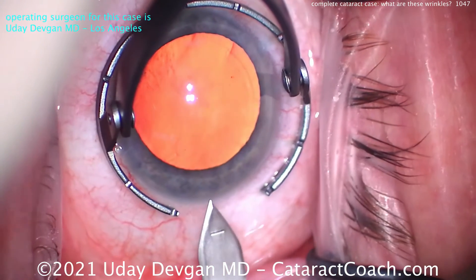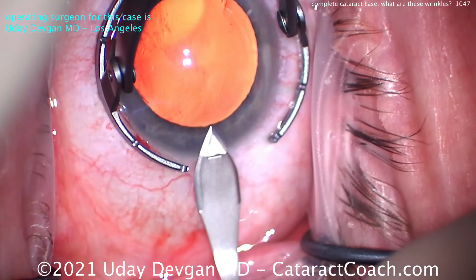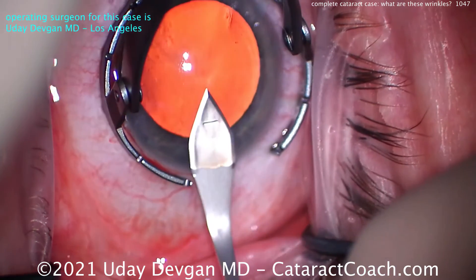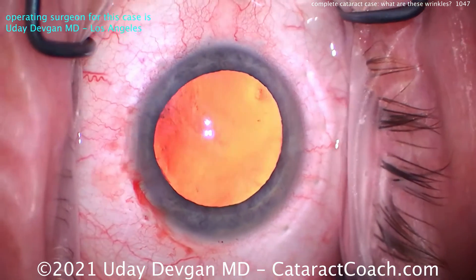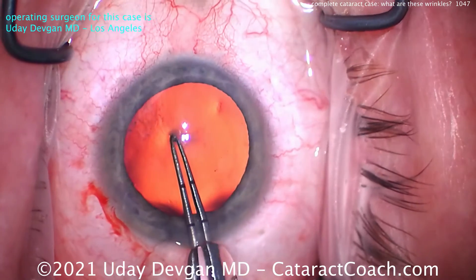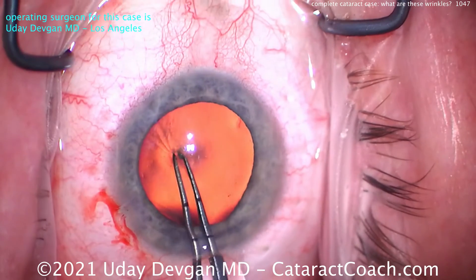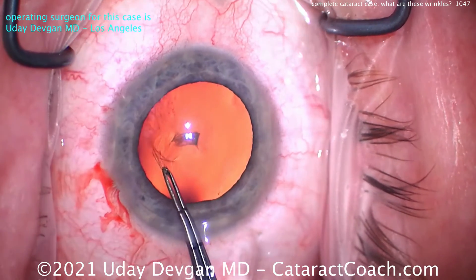Let's make an incision here. We start the incision and tunnel length looks pretty good — just about perfect, that's beautiful. Now it's rhexis time. Watch carefully — here's where we saw those wrinkles on the opening slide. Going inside here, measuring where we wanted, good. Poking in, and nothing yet. Poking in — those wrinkles are not too bad actually.